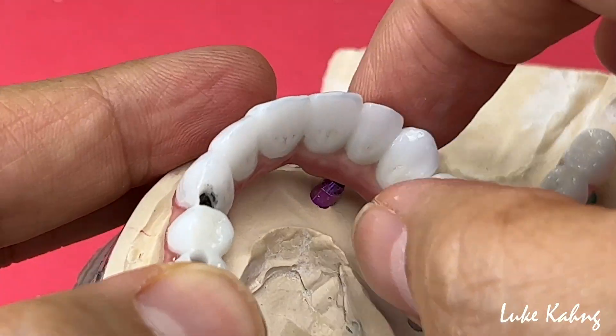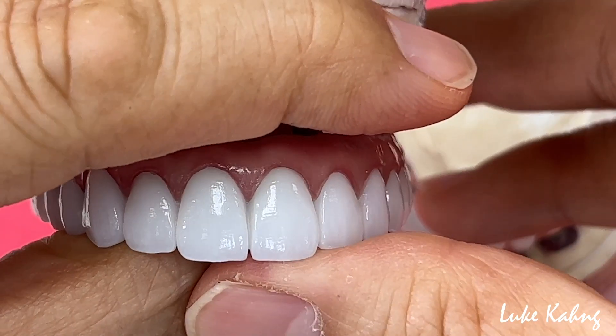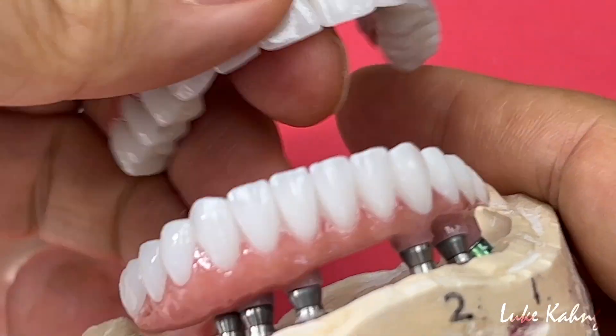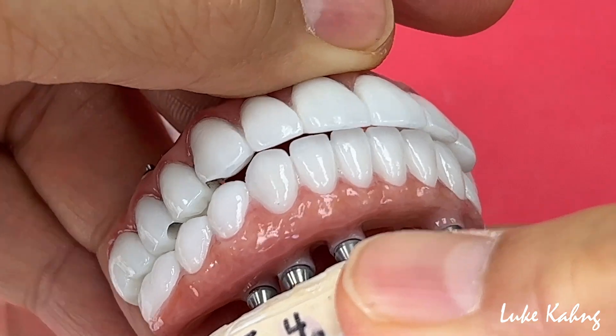It's extremely thin and the long span — for anteriors, zirconia is not recommended. Here is the zirconia with the ti-base together. This is the top of that — and it is too close, upper and lower.